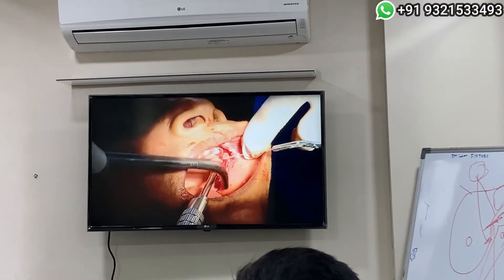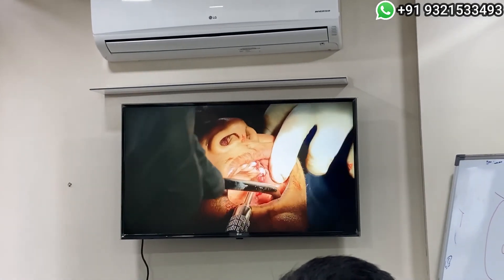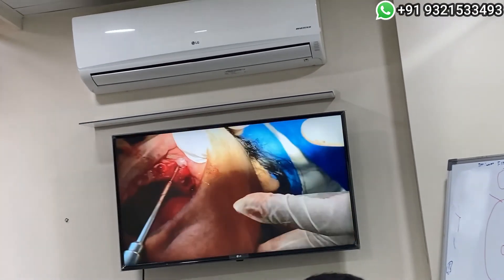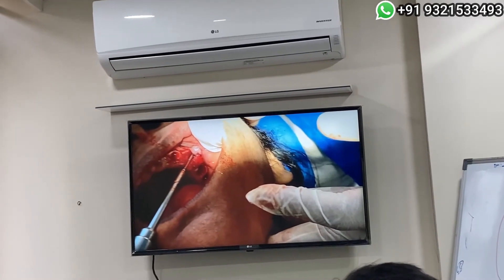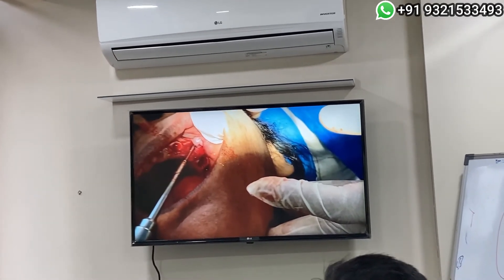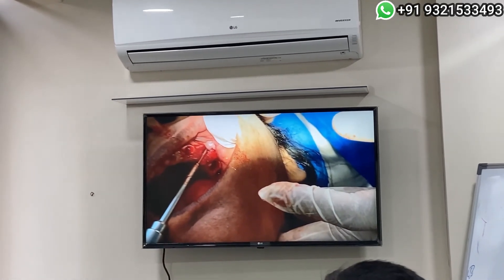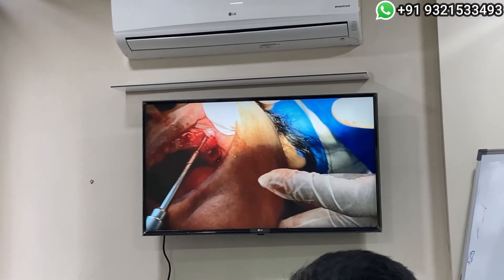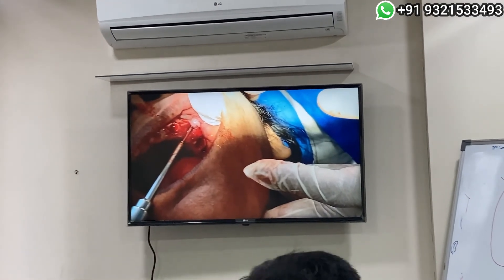If I get a view where I can show the whole tunnel and the new one — when I showed this to Dr. Mithil, my friend, he said that the earlier position was for a second zygoma. So if I had done a double zygoma, that would have been okay. But for practical purposes, we remain in the center of the zygoma, and this is how it will be with this zygoma.